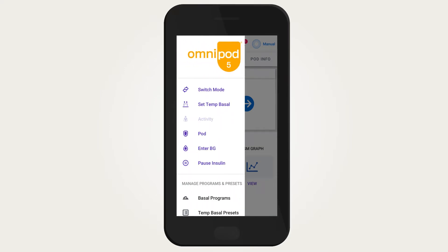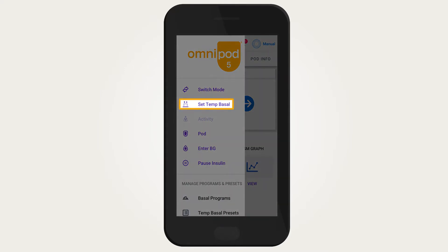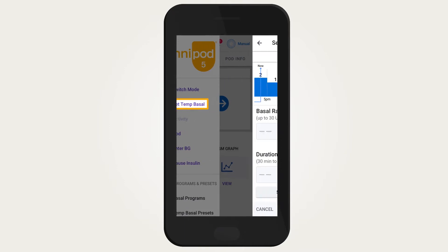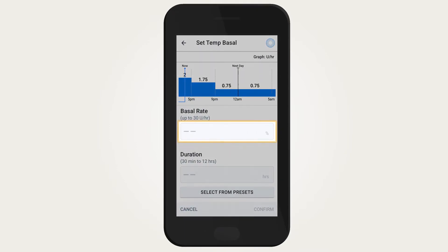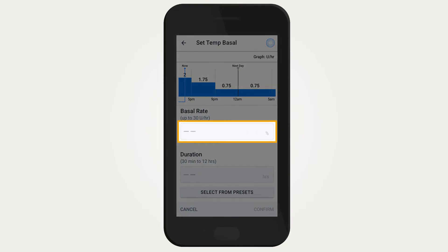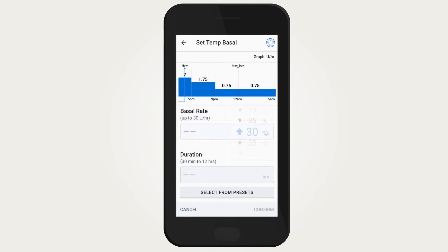Once the menu is expanded, tap 'Set Temp Basal.' Then tap on the basal rate entry field to enter the desired change in basal rate.